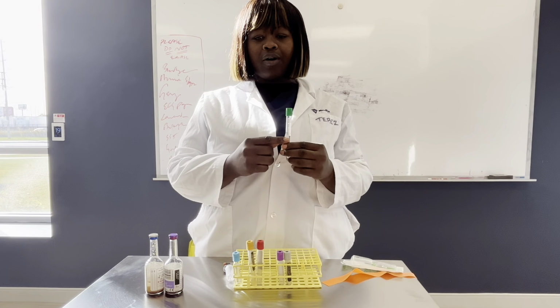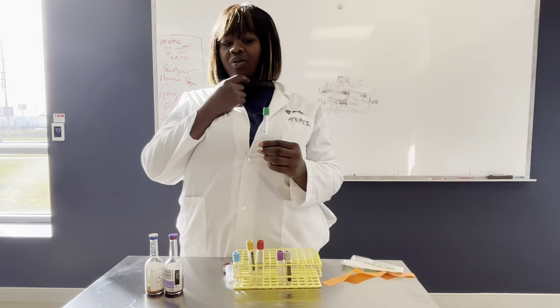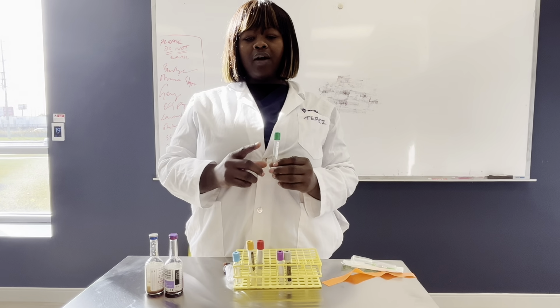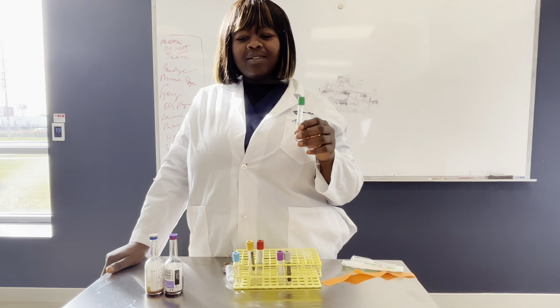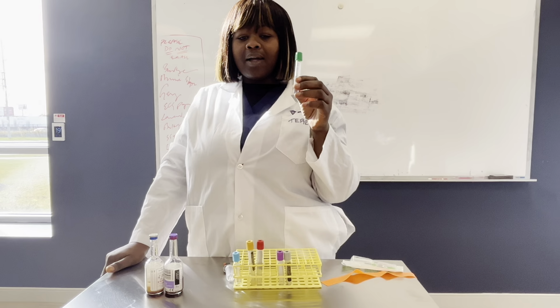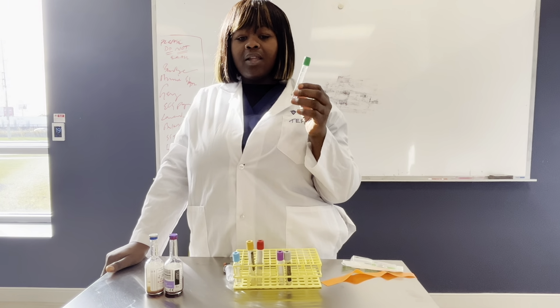Heparin, a naturally occurring anticoagulant, works by inhibiting the clotting cascade through the activation of antithrombin III, thereby preventing clot formation. This ensures that blood collected in green top tubes remains in a liquid or anticoagulated state, allowing for the collection of plasma rather than serum.